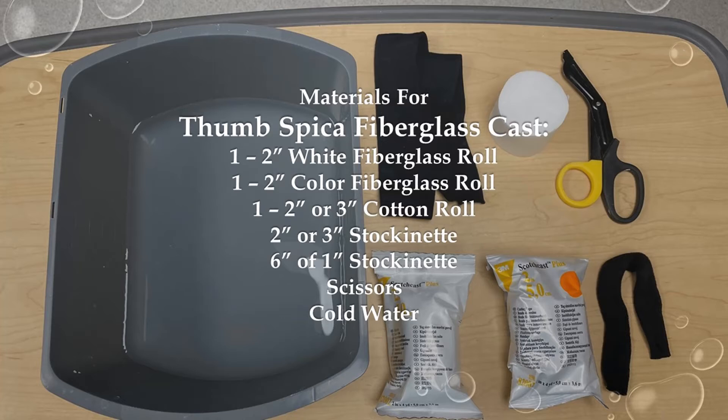To prepare for the Thumb Spica cast, size the 2 inch or 3 inch stockinette from the MCP joints to 2 inches before the antecubital fossa, and leave about 3 inches extra on each end of the stockinette. Do not open the fiberglass until you are ready to apply it, because it will harden when exposed to air. Make sure you have cold water ready.